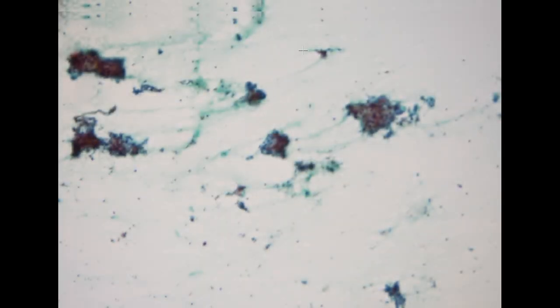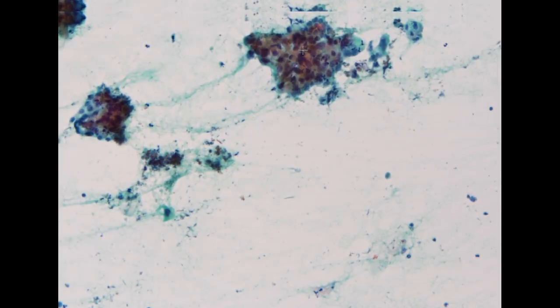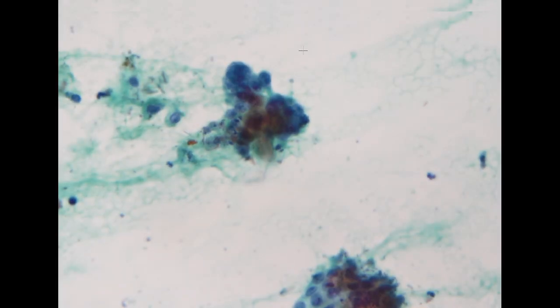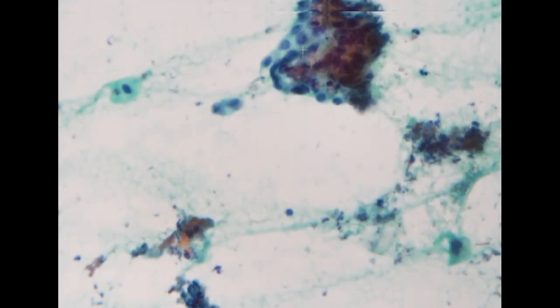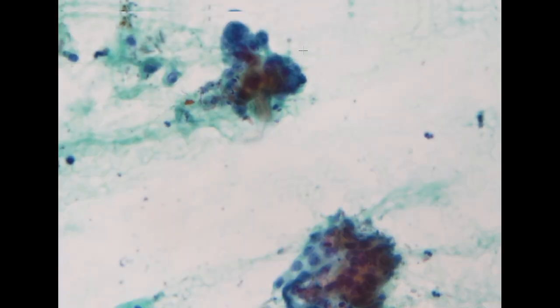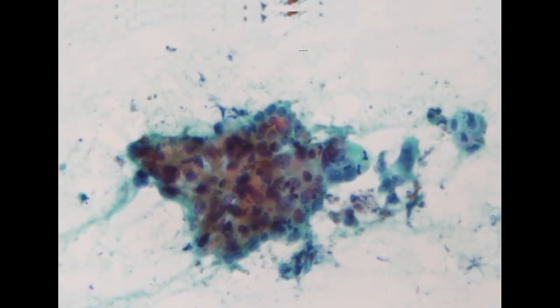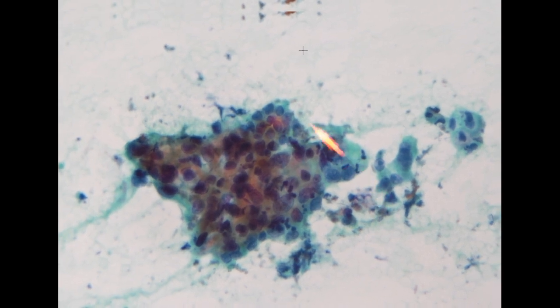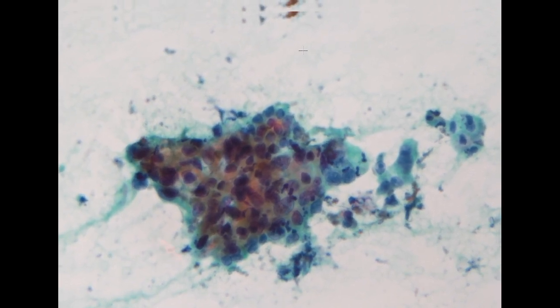Common bile duct cancer is very similar to the pancreatic cancer that we commonly encounter in our ultrasound-guided FNA. So here we do identify multiple tight clusters of three-dimensional glandular cells demonstrating unequivocal nuclear atypia, showing this 1 to 4 pattern and a very irregular arrangement.